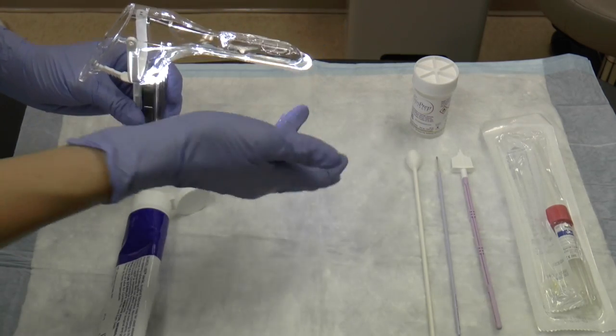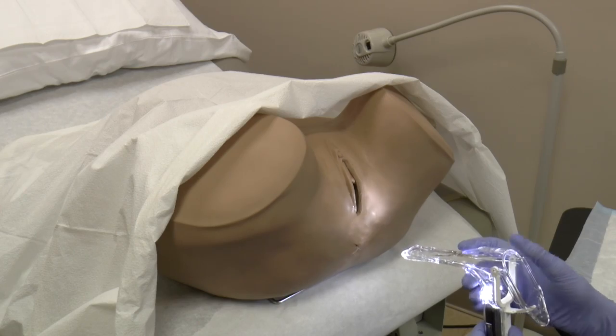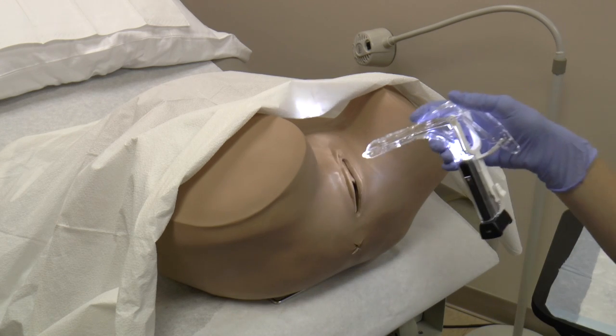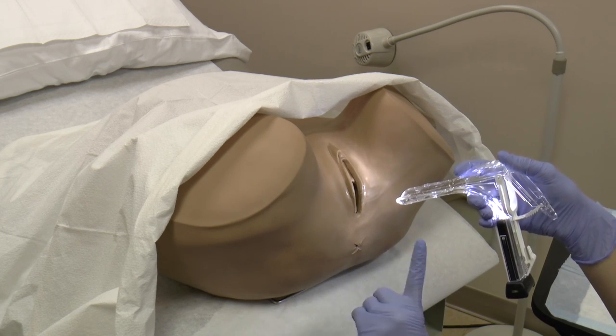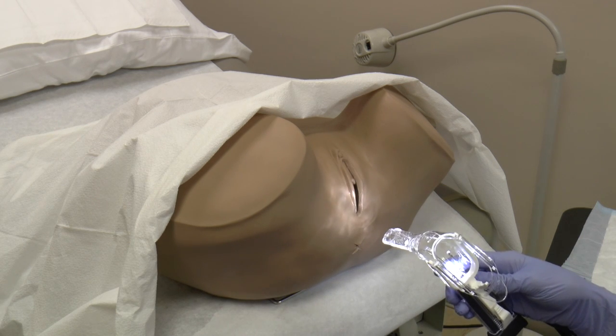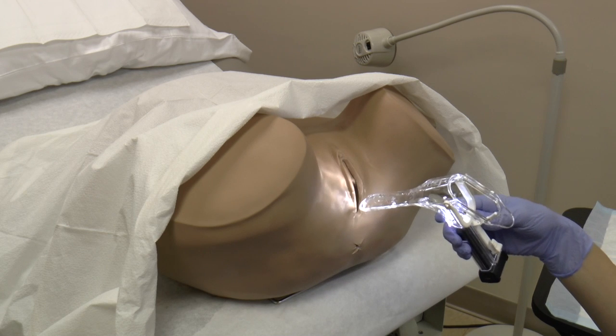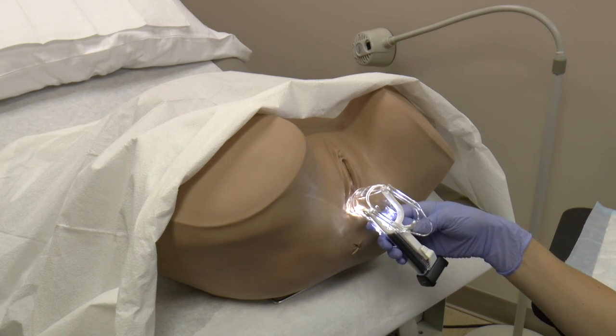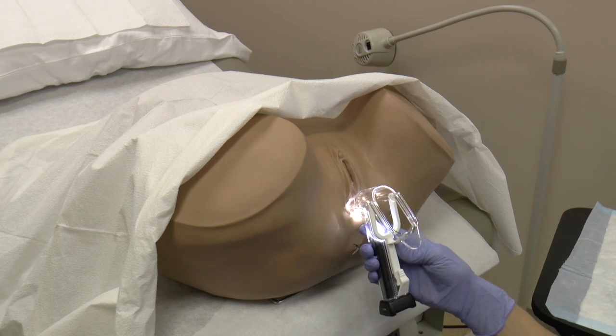Apply lubrication to the speculum. The urethra and clitoris are very sensitive. Avoid hitting them with the speculum. Always aim posteriorly when inserting the speculum. Hold it at a 45-degree angle for insertion. Once the speculum is fully inserted, rotate it and open slowly.